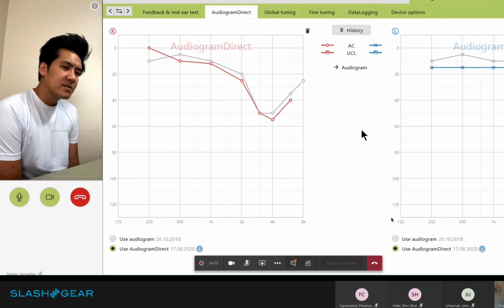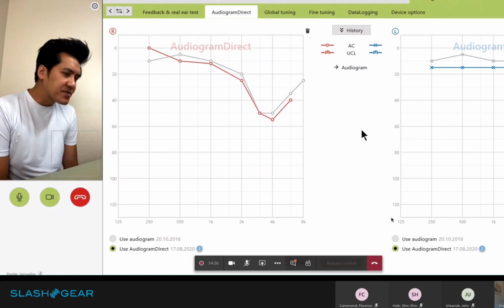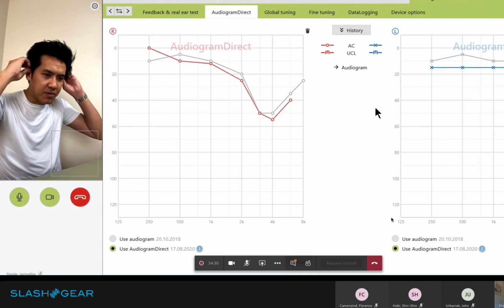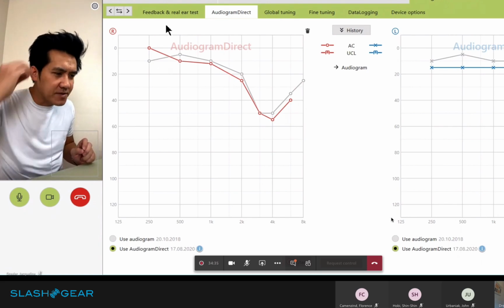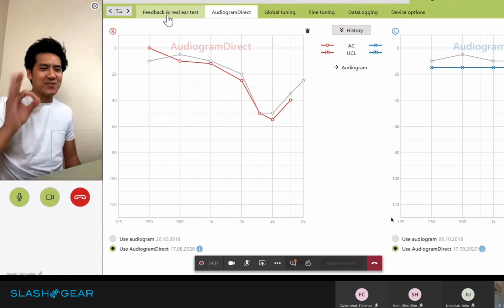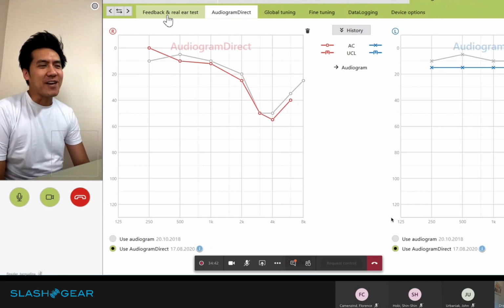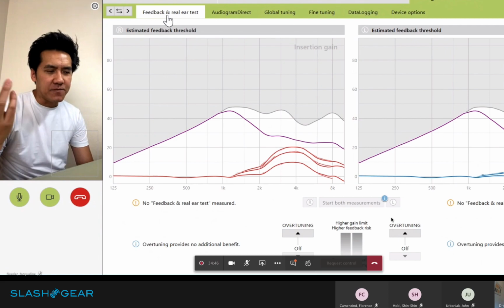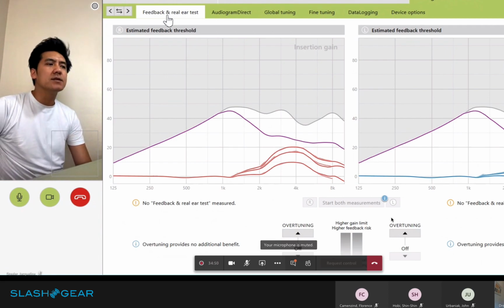Okay, and what does this sound like to you when you hear this high pitch? Like a feedback almost? Yes, kind of like a feedback almost. And then I would try to lower the volume as much as possible. Wait, are they disconnected now, or do you have control of them? Is that why I can't? Okay, that's why. I was like, wait a minute. Okay, so you have the control. So yeah, I would then just lower the volume a little bit, and they're fine. But it doesn't happen all the time. It's just maybe once or twice a day.